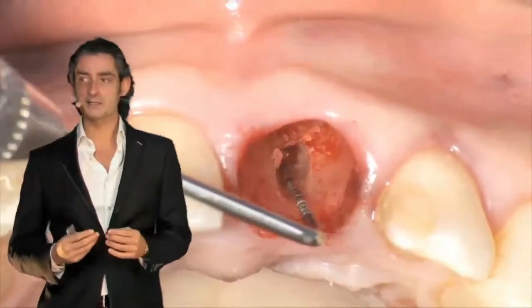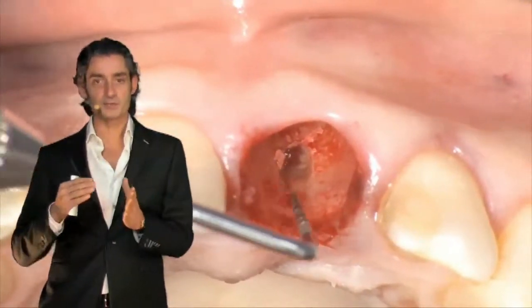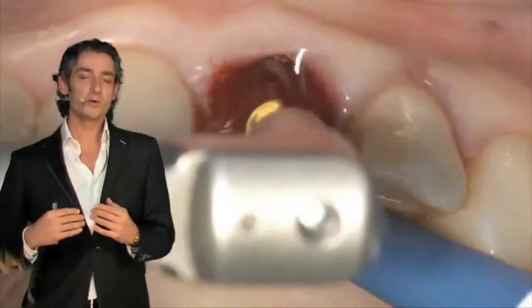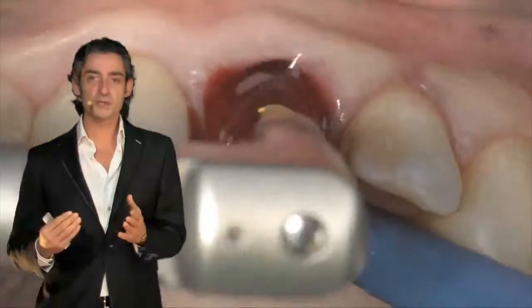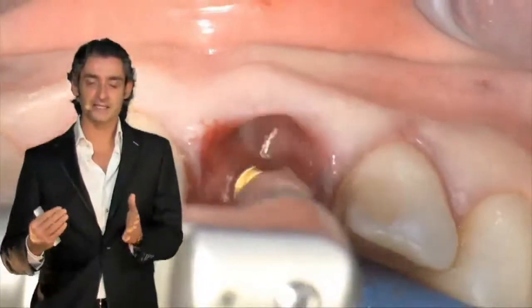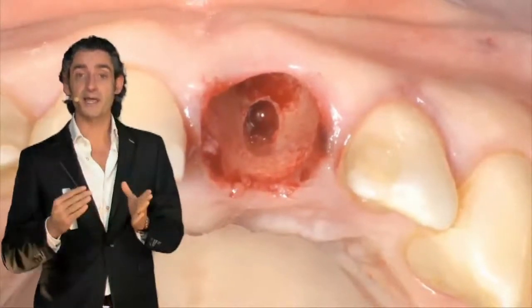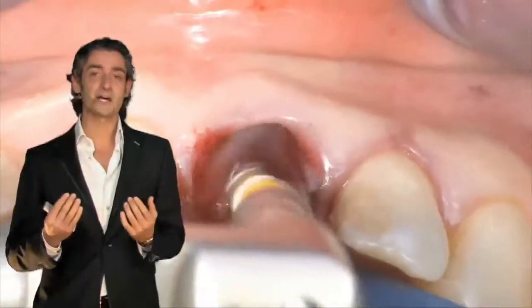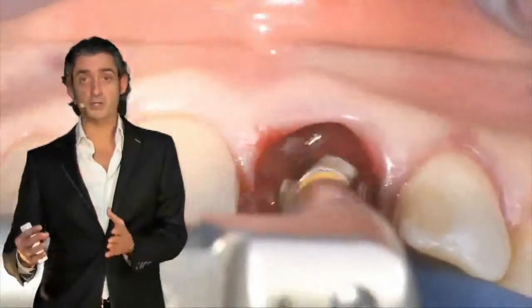And then it's really important for us to check if the position is right, everything is done, and then we can go with the sequence of drills that we use normally, considering to maintain exactly the axis. The axis that we decided before, so it's not the axis of the root that was there before. So we are on the palatal side right now. It depends on the quality of the bone.